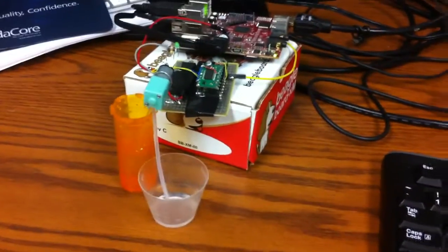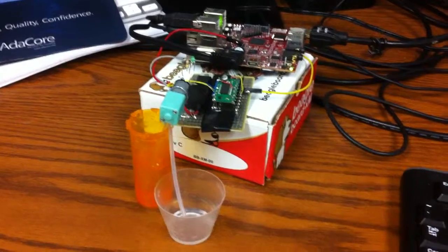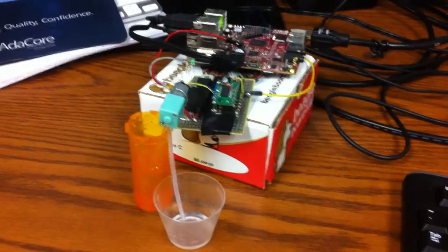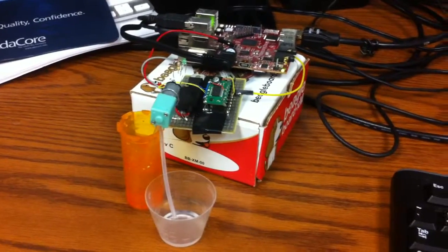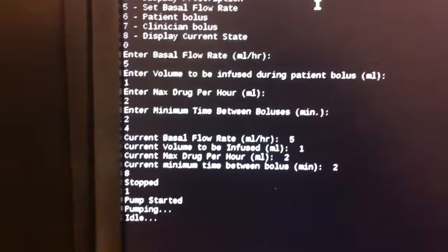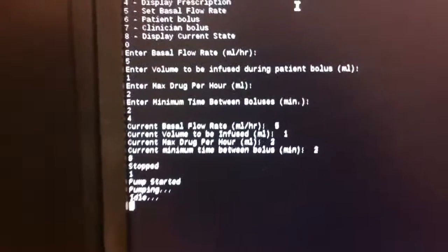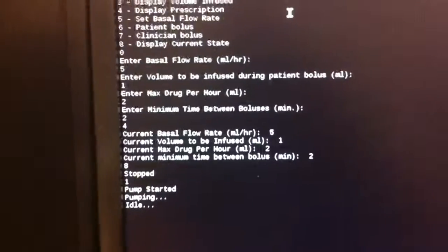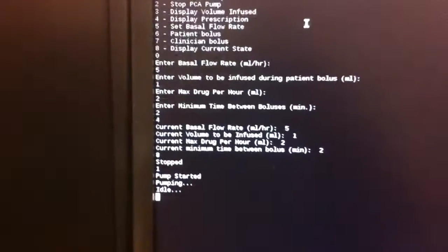in such a way that it doses basal and all other infusions in 0.1 milliliter increments, which means that when there is, for example, a 5 milliliters per hour flow rate, it will issue 50 pulses every hour, which is a 0.1 milliliter dose every 1 minute and 8 seconds or something like that.